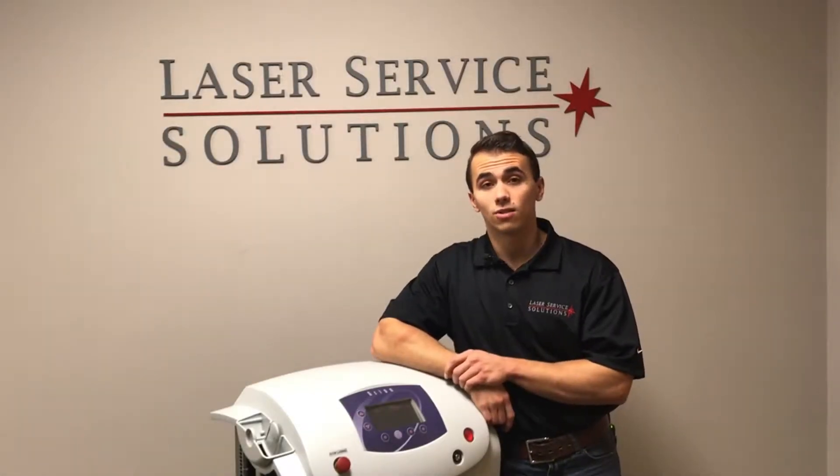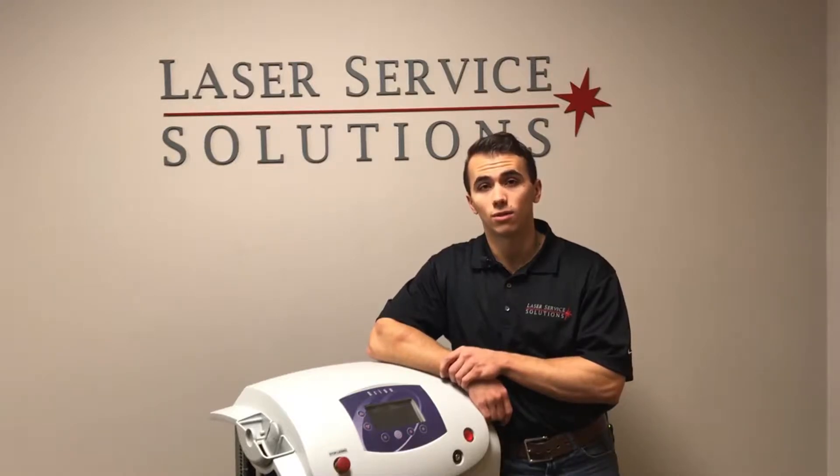Hi, my name is Austin. I'm a technician here at Laser Service Solutions and today I'm going to show you how to drain your Alma Harmony original system of water.